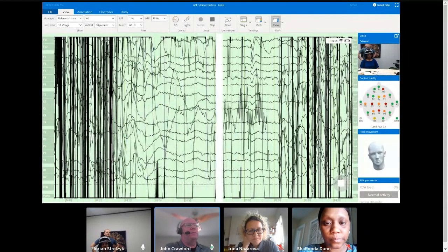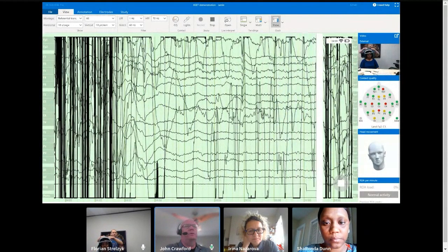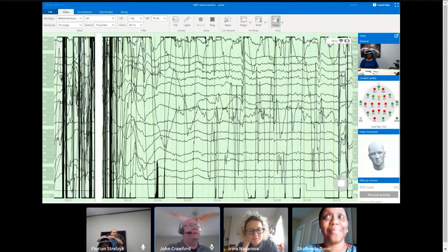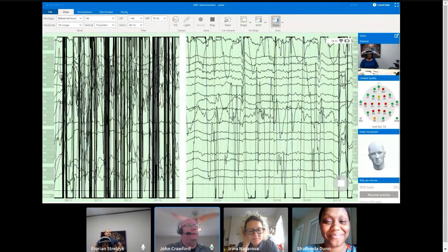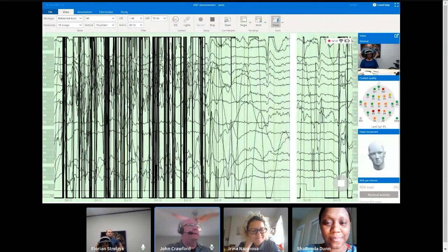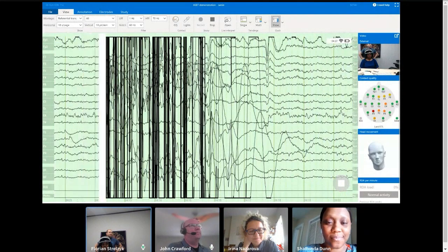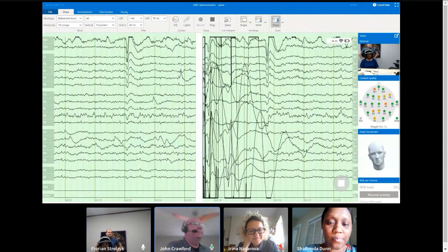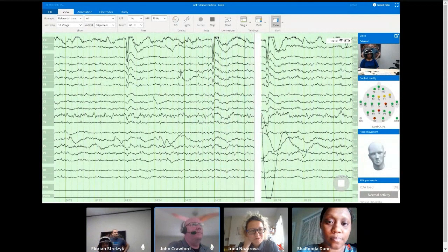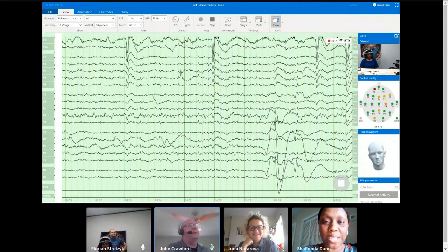So he's made some adjustments. He's standing back, and this is one of the hardest things for EEG techs to do. We're so used to making an adjustment, scrubbing the headset, putting the electrode back down, and if it doesn't immediately become green, we immediately touch it again. And that's not what you want to do in this case. Mark to you 4 minutes, 20 seconds. There you go. No, it'll settle down because all of them look good.